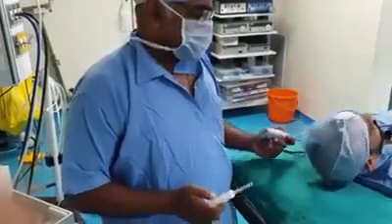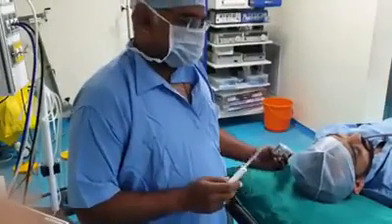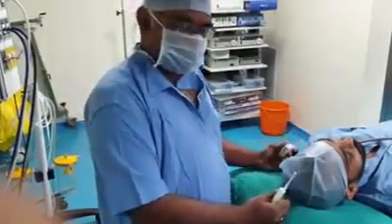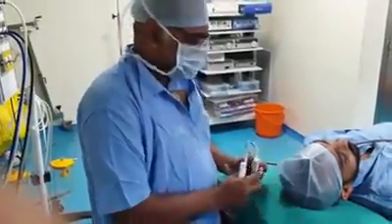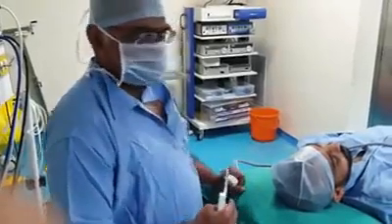Hello everyone. So today I am going to show how a sphenopalatine ganglion block is done. This is just for a demonstration. I have a volunteer, he is our anesthesia technician. So first most important is the ergonomics.